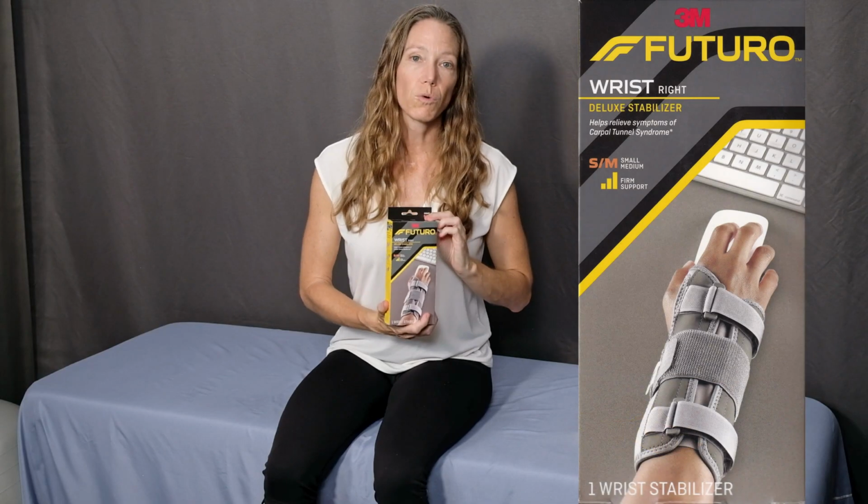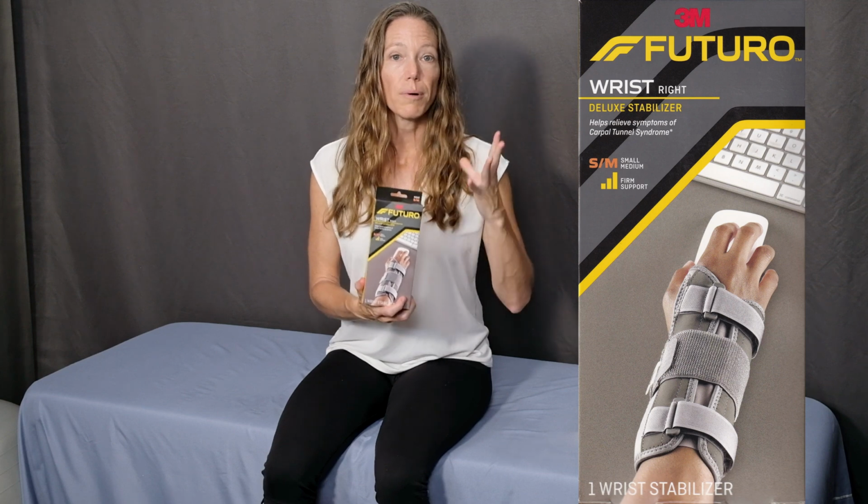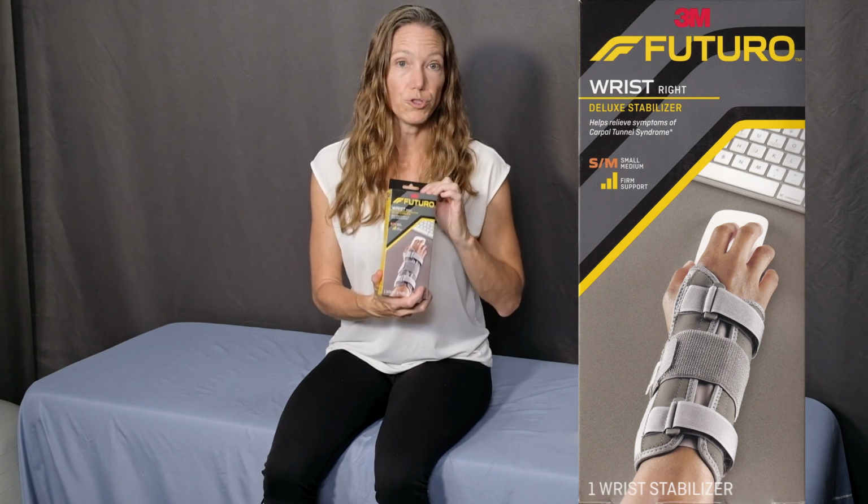The other component to look for is whether the brace is fixed left or right side or if it's adjustable, and be sure that you're choosing the appropriate brace for your needs. Finally, consider fabric. If you know you have an allergy to certain fabrics, be sure to avoid that fabric in the brace. The first one is called a stabilizer because it stabilizes the wrist by limiting movement through the joint.